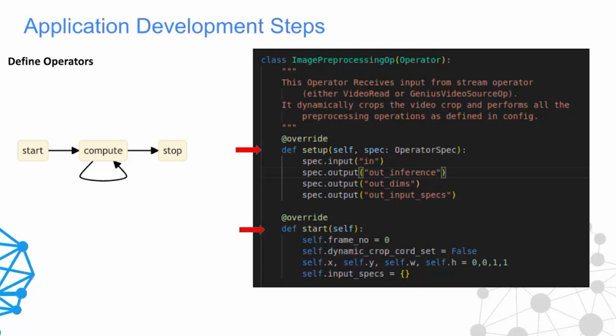These are the main methods that, as we discussed earlier as well, we need to override as part of the implementation. Setup is where we define all the input and output specifications. These named ports are then used to communicate and receive and transmit the data to the next nodes. Start is where we initialize any state variables that we want to keep, in the start method.